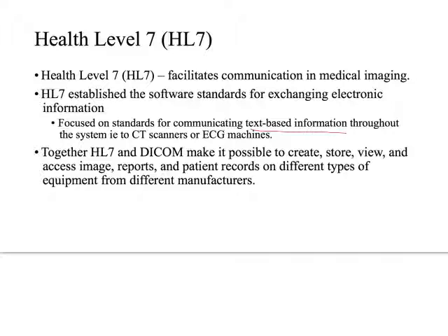And the significance here is that this HL7 connection, if it's not active, if you've ever been in a facility where you've had to manually enter patient information prior to doing imaging, they probably just lacked some kind of HL7 connection. There are machines that are out there that people are still using that were made before this compliance system, or for whatever reason the networking is down. But if there's a difficulty in communication, so this is the troubleshooting issue I'm trying to drive at: if you are not getting patient information at your imaging station, like where you do your CT scan or your X-ray, probably the error is in the HL7, not in the PACS or anything like that.